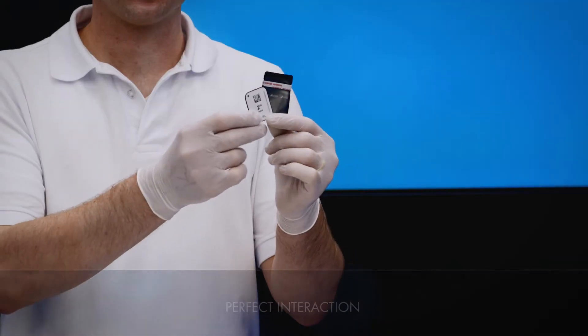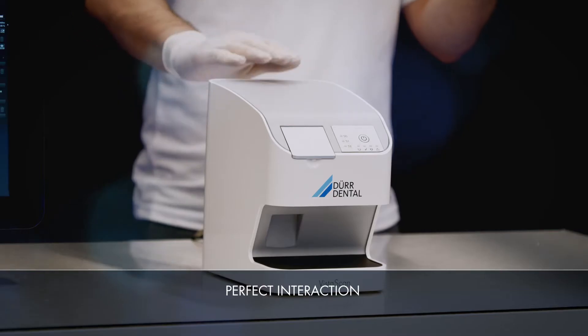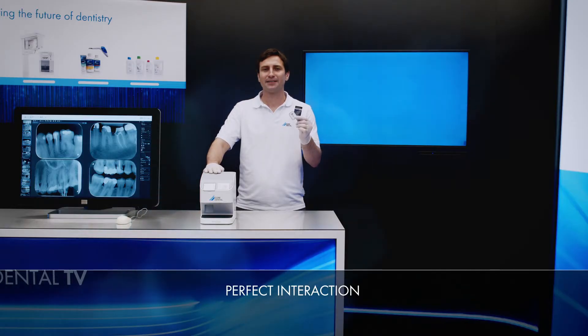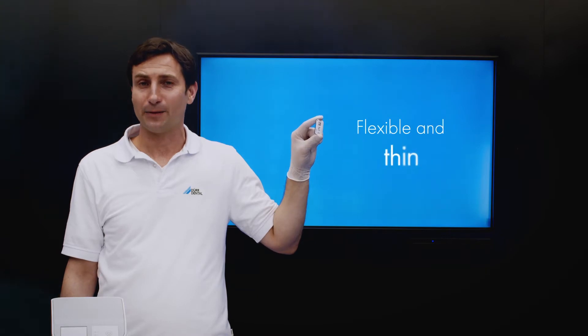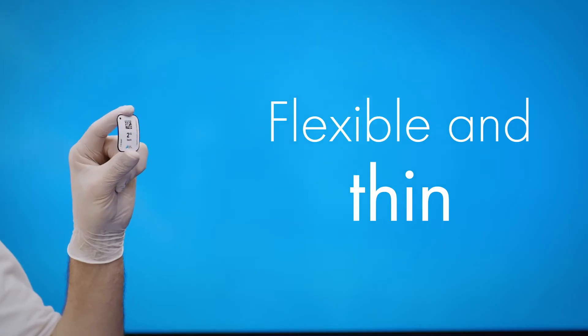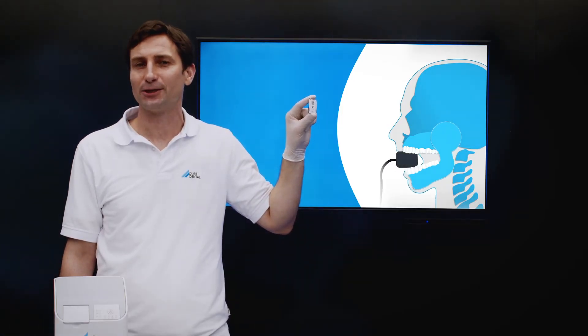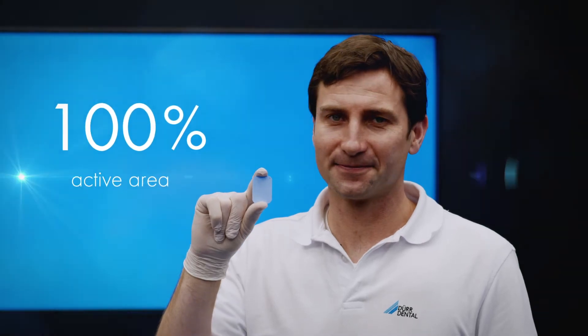DoorDental light protection covers, VistaScan IQ image plates and the VistaScan NanoEasy are the perfect partners for maximum image quality. VistaScan IQ image plates are thin and flexible. Thanks to this flexibility, they are much easier to position in the mouth of the patient than, for example, a sensor with a rigid housing. VistaScan IQ image plates offer a 100% active area compared to sensors.